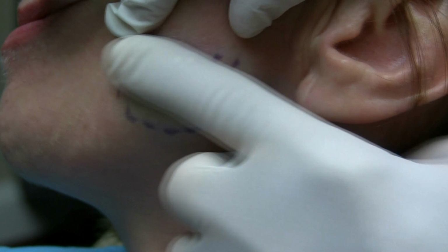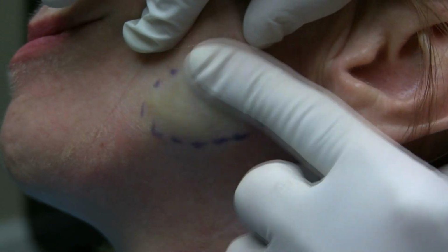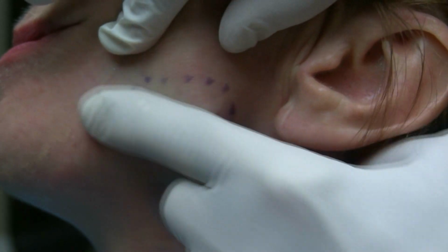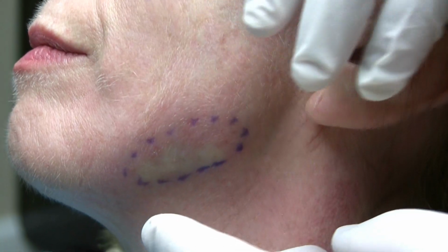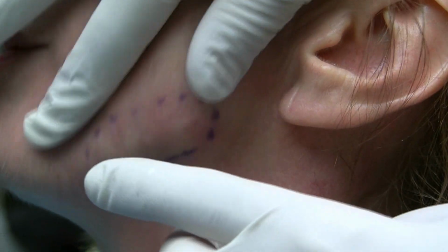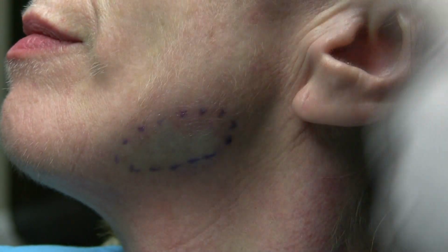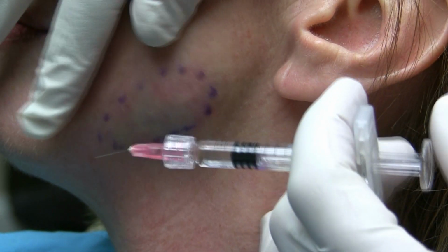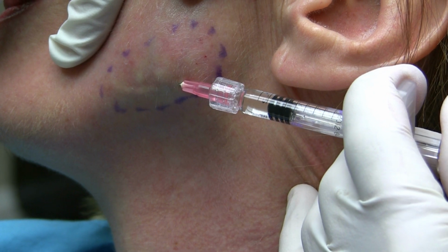I've made the statement many times that on some patients fillers go further than others, and I'm not sure if that has to do with the thickness of the dermis versus the epidermis, the amount of subcutaneous fat, but on this patient it's actually going pretty far. We've used just over half a syringe, and I've got definitely a noticeable result here. So we will continue on this line, and we have 2 syringes budgeted for this area, so we'll be able to do a lot with it.